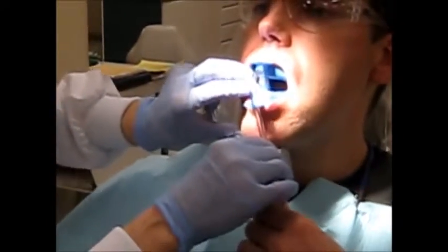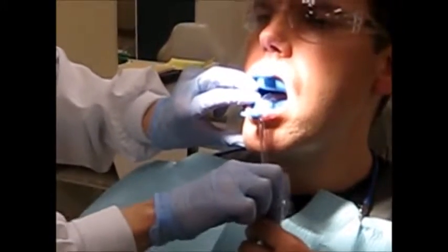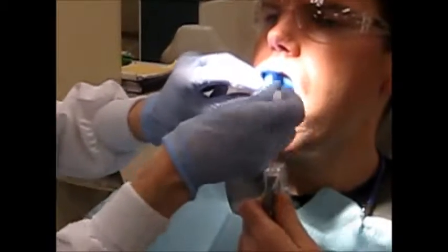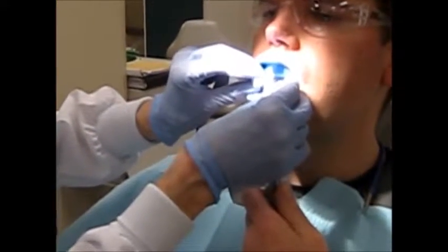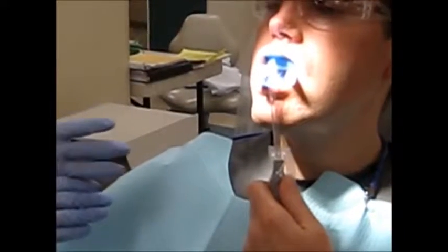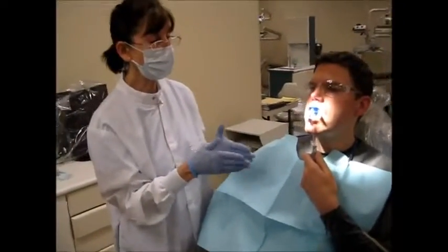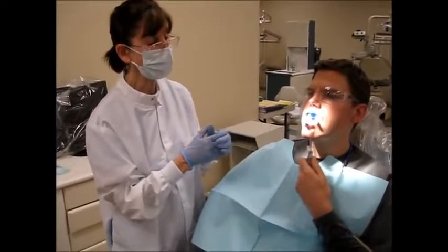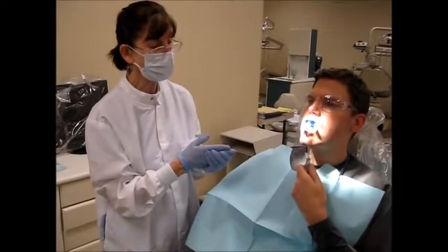Replace the saliva ejector immediately, asking them to stay wide open. Breathe through the nose, not to swallow. Place cotton rolls on either side of the saliva ejector and ask the patient to gently bite down. You would remain with the patient at this point for 4 minutes in order to have the most benefit from fluoride uptake. Initial uptake in the first minute is 80%. In the remaining 3, it's 20%.